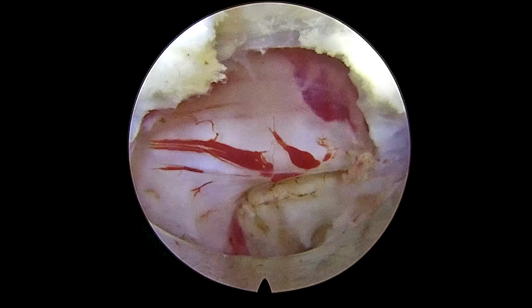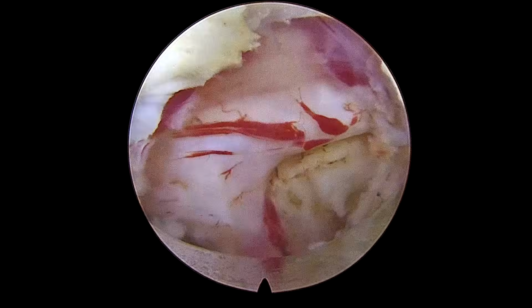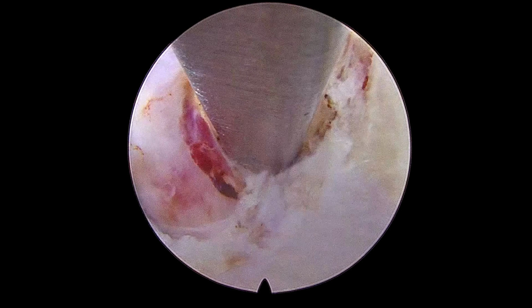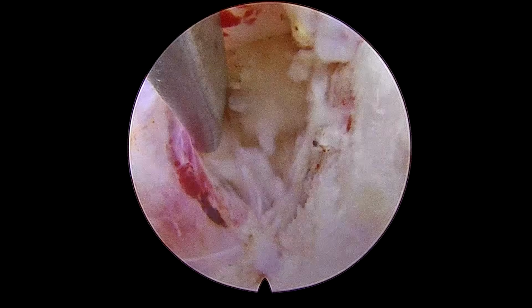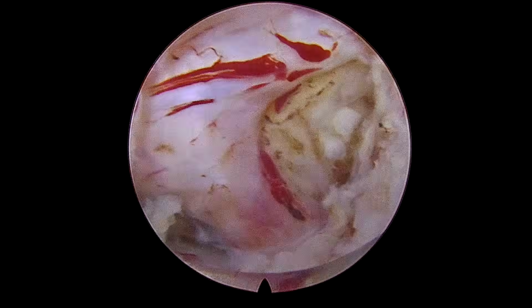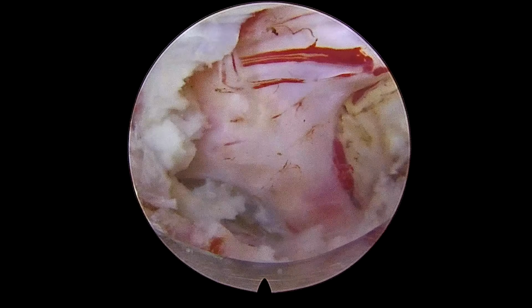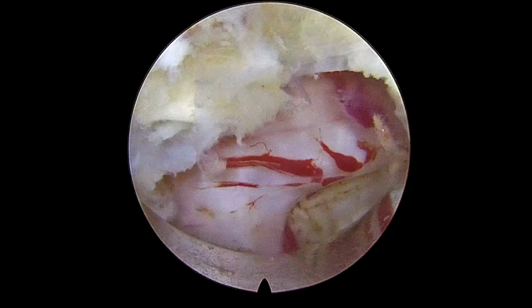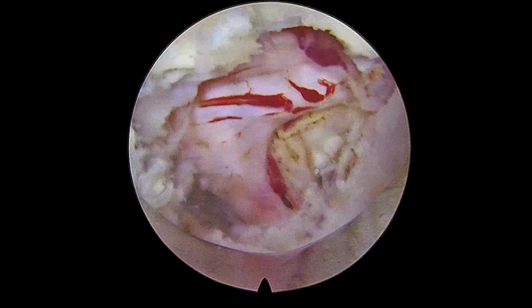You can see here the root is swollen as well as tense because of the disc fragment. First we'll remove the fragment from the axilla, then we'll search for any fragment underneath, as well as in the shoulder area. You can see here that is the fragment in the axilla. With the help of the hook, we'll just tease that fragment.